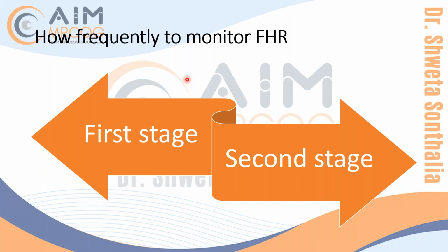Very good. The baby is sleeping. Yes, it's possible. See, variability will always be there even if the baby is sleeping. So if you are not finding any variability, like you're constantly listening to 120, it is not a good thing. Either the baby is really, really suffering, that's why there is no variability, or you are picking up the maternal pulse. This is what you have to understand in your practical placements when you do CTG monitoring. If there's no variability, sometimes it could be because you're picking up the maternal pulse, or the baby is really suffering from hypoxia.